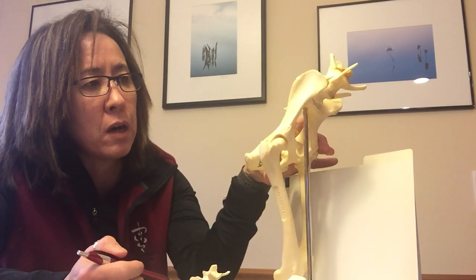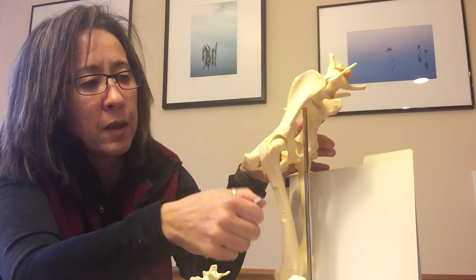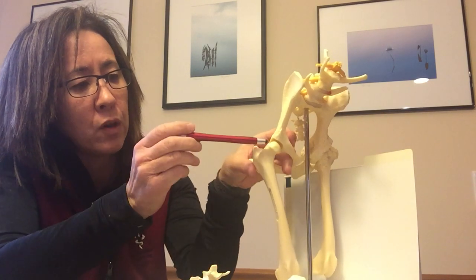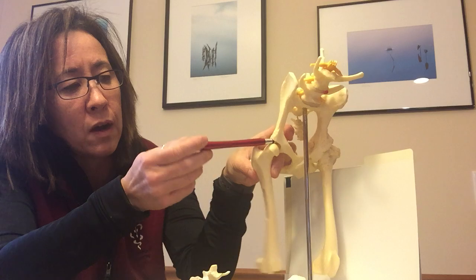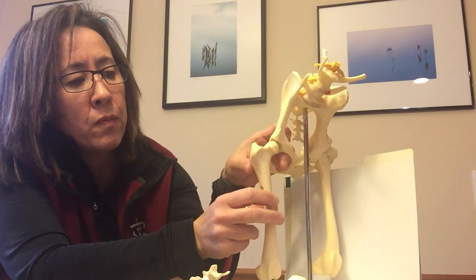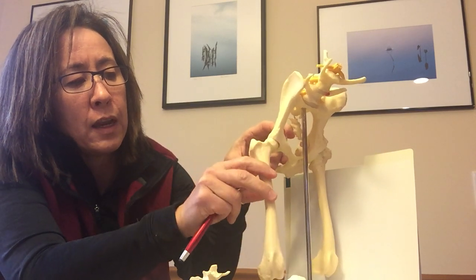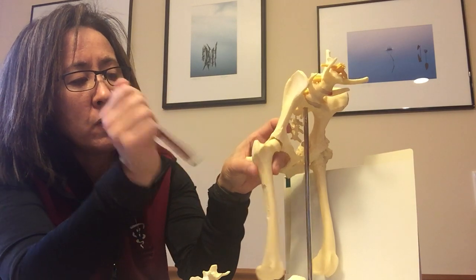If we take a look at this model here, the head would be away from me and the tail would be towards me. The hip is what we call a ball and socket joint. The ball portion is the femur and the socket portion is what we call the acetabulum on the pelvis, and the ball should sit really nicely in the socket with a nice gliding motion due to the cartilage on the ball and within the socket.